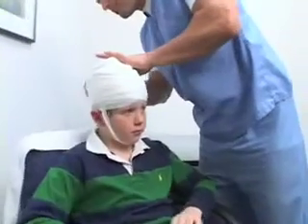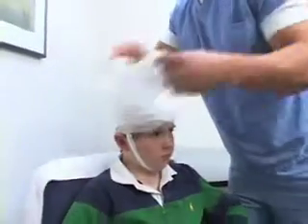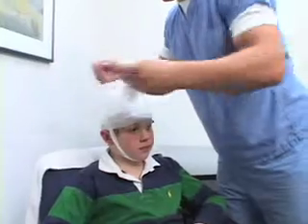When you return for your disconnect appointment, the head wrap electrodes will be removed and the technologist will prepare the data for your physician to review. During your follow-up visit to your physician, he will discuss the results of your test, provide your diagnosis, and talk with you about your treatment options. Medications are often prescribed to treat seizure disorders.